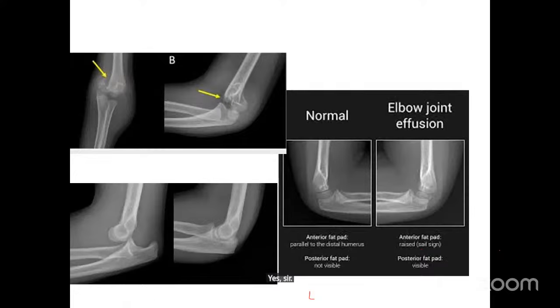The adjoining joints, both proximal and distal, are not there. Yes. The general rule is that you must see the two joints associated with it, proximal and distal. For something to cause this, there must be an effect on the proximal joint. Are we together?